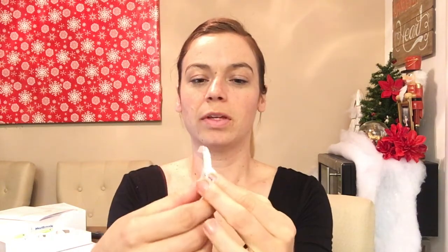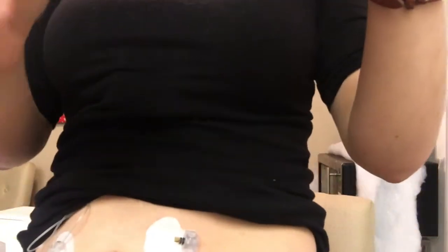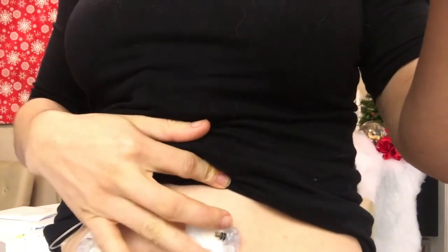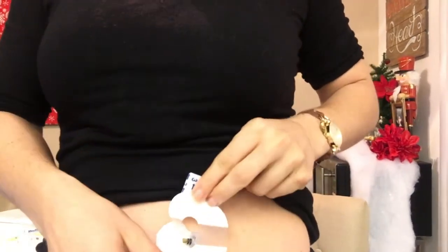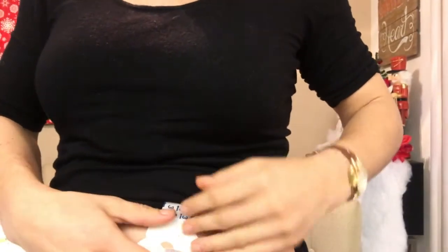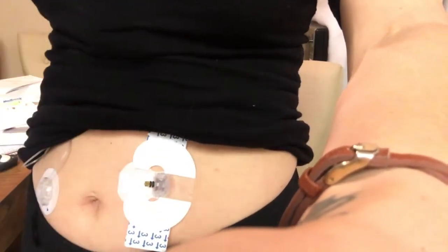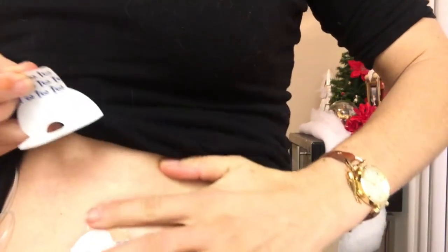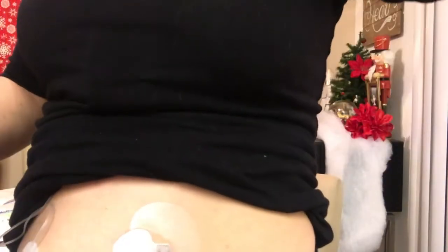So what I'm gonna do is put the thicker piece towards the end of my sensor, which is right here, and then the little piece right in front. I hope you can see — I'm a little short and I'm on a tripod. Then I'm gonna go ahead and take off these other little flaps and another little piece. There we go.